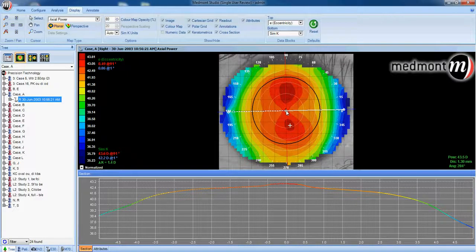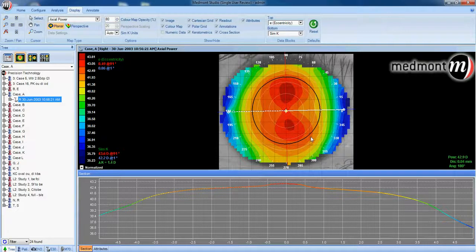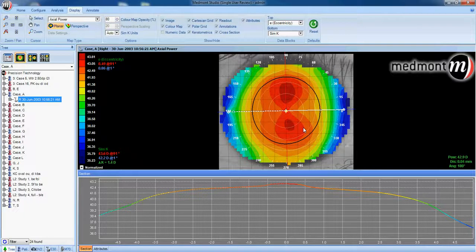The center of the topography would be the visual axis — this would be the point the patient is fixating at the moment the map is taken. We could look at the 3 millimeter, 5 millimeter, and 7 millimeter white rings and the pupil, which is in black here. We can use either the pupil or the rings to determine the position, shape, or size of any anomalies in relationship with the visual axis, with the pupil, or to a certain diameter away from the apex.